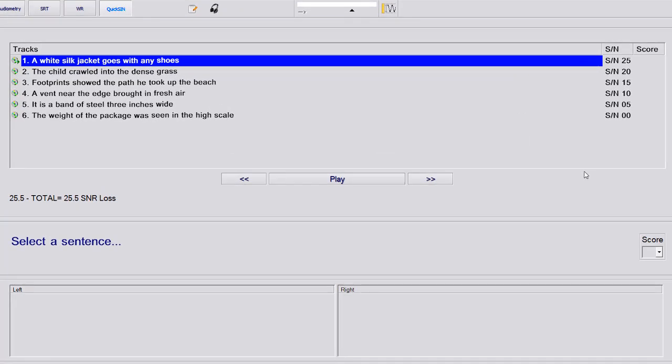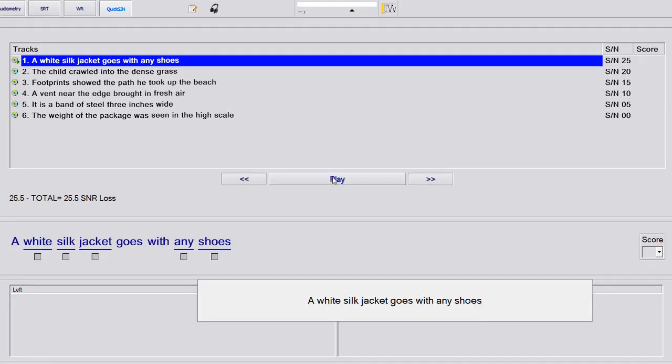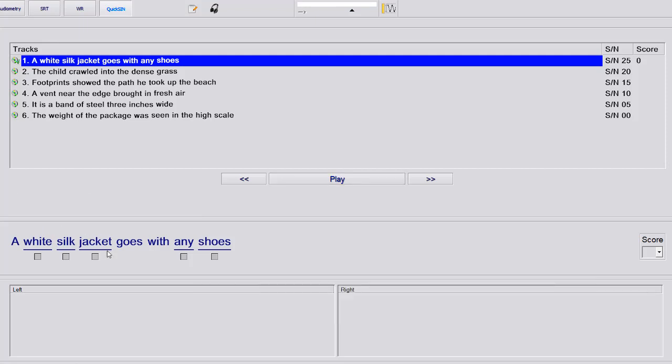So we've got our list here, we'll hit play. It's going to say a white silk jacket goes with any shoes, and you're listening for the underlined words. So you can select the individual words they got correct and hit the next button.